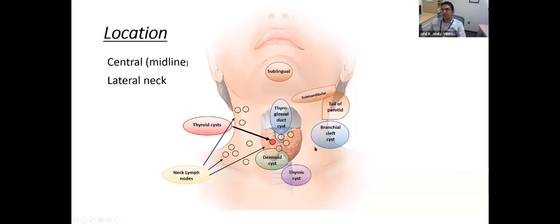To complicate this further, we also have scattered lymph nodes throughout the neck, and those can be central in level 6, but they can also range from level 1 up to levels 4 and 5. So it's always a good idea to communicate clearly with the performing radiologist or clinician about the location of the lesion that is being FNA'd.